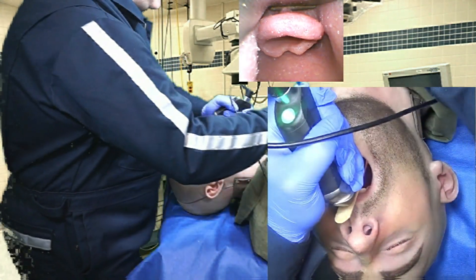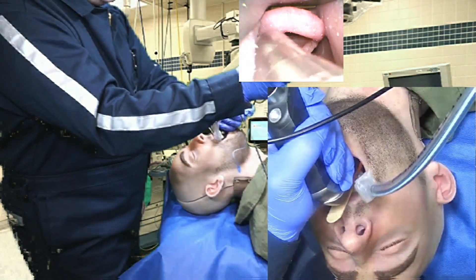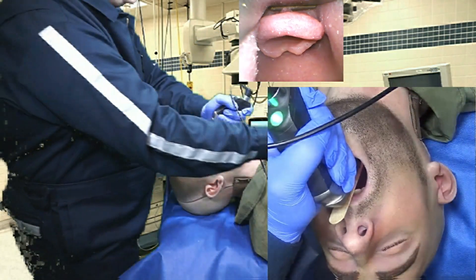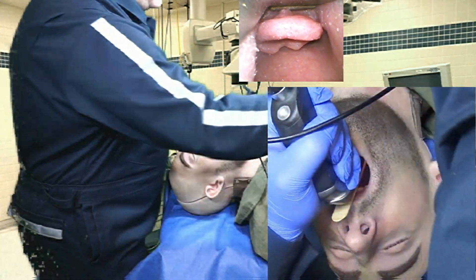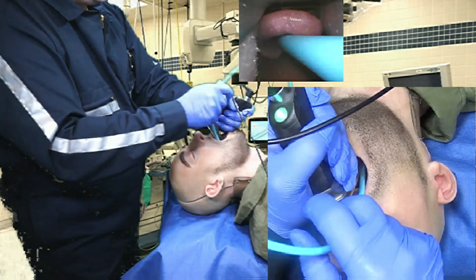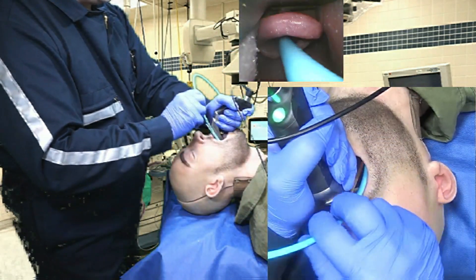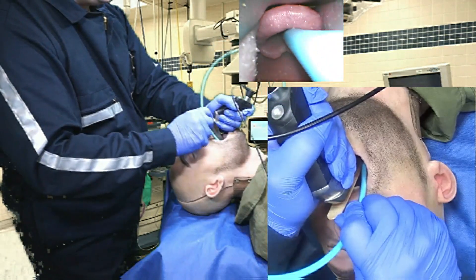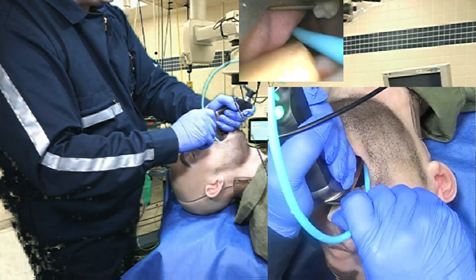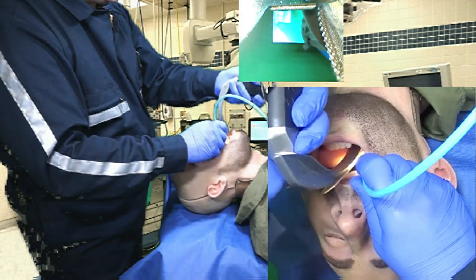For tracheal tube delivery, first things first — the rigid stylet. That's easy peasy. Now I'm going to use our bougie, and this is working very well with the C-Mac. I'm going to have to turn it posteriorly to go down into the trachea. And there you have it — very nice.